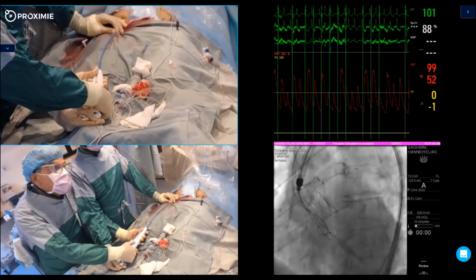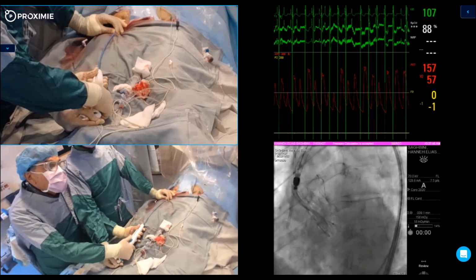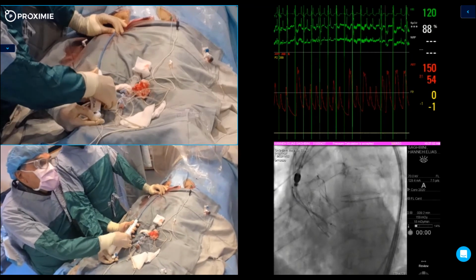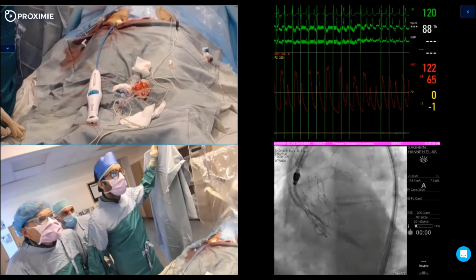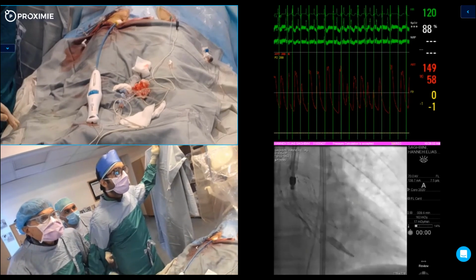Okay, keep turning. So in the Portico, there's 3 tabs. So you want to make sure the 3 of them are disconnected. Go to a hard stop. Go. Okay, so I'm going to do a sweep. It seems one seems to be still attached.